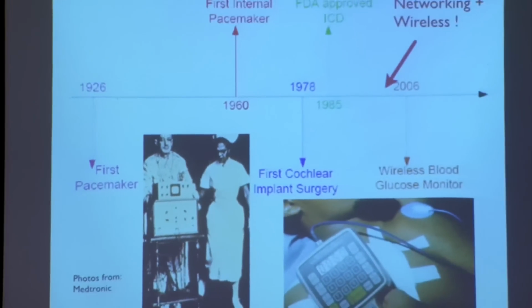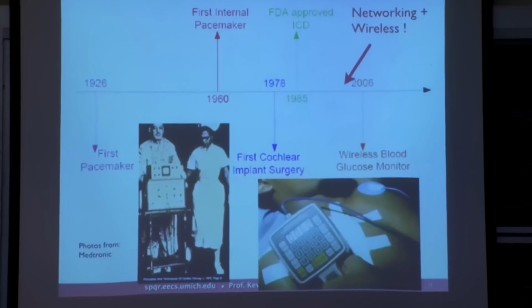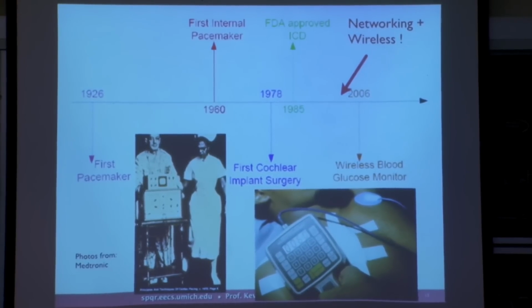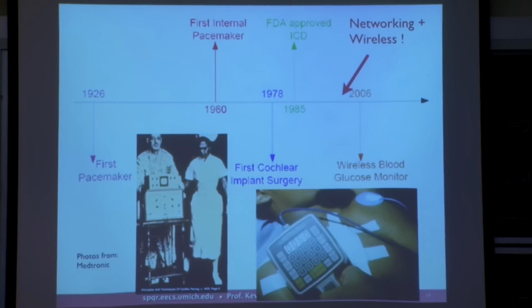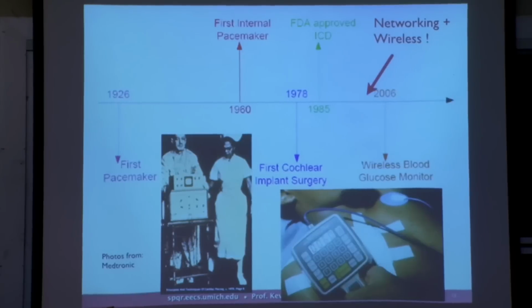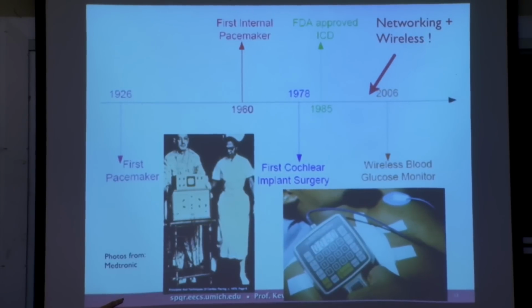About 50 years ago, some of the first pacemakers started to appear on the scene. They were external. You had to have a burly nurse to cart it around. And then as the decades wore on, they became small enough to be completely implanted in the body. And here you see a picture of what's called a wand that's using inductive coupling. It's technically wireless. There are no wires. To wirelessly program the device to be 60 beats per minute.